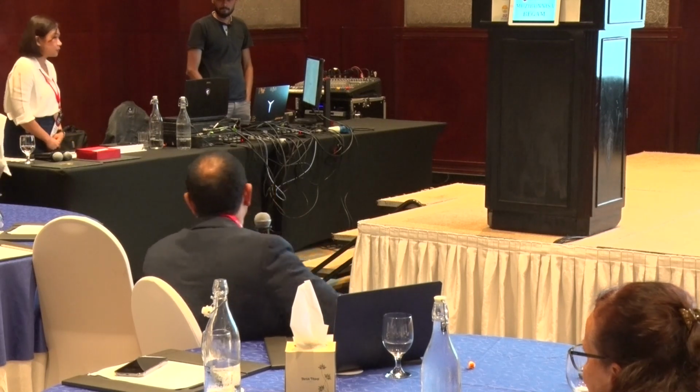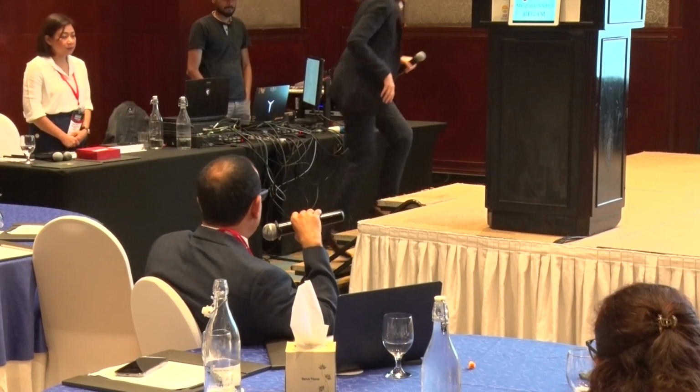Okay, so Dr. Diana, do you have any cases that you want to mention? Do you have any of your collection? Please, please. I would love that. Thank you. And it should be there. It should be in there. But I only have one sweep. Actually, it may be a little challenging for us to look.